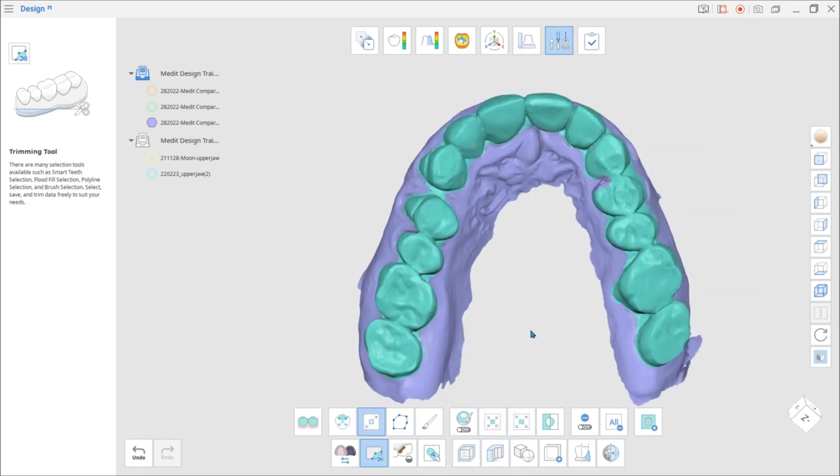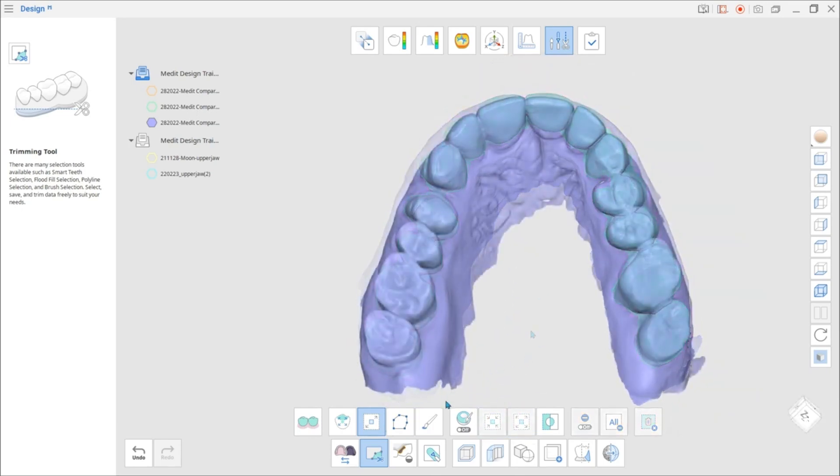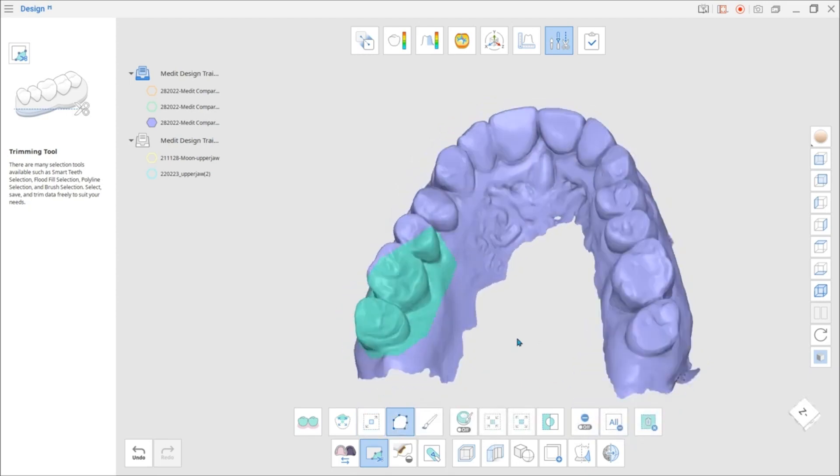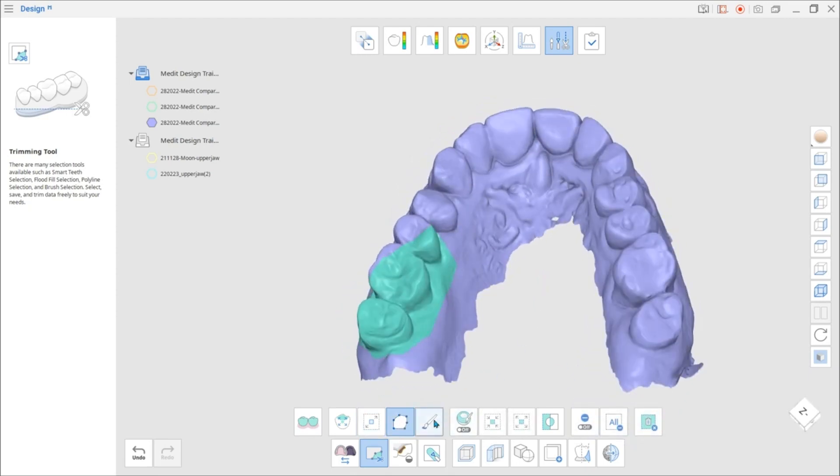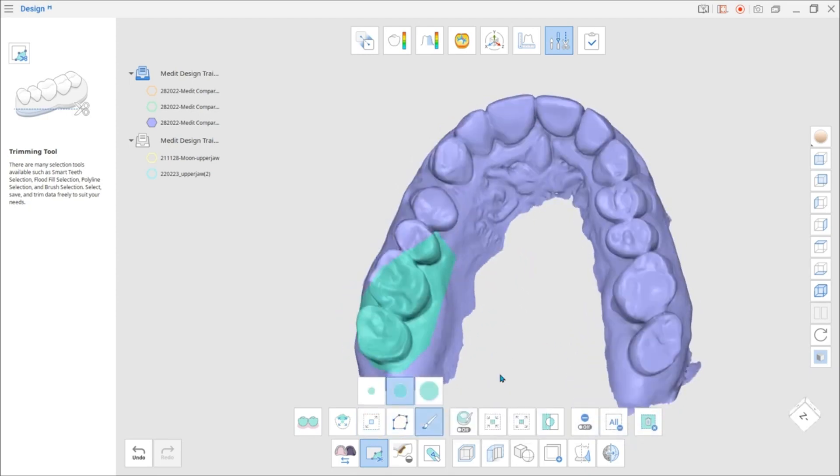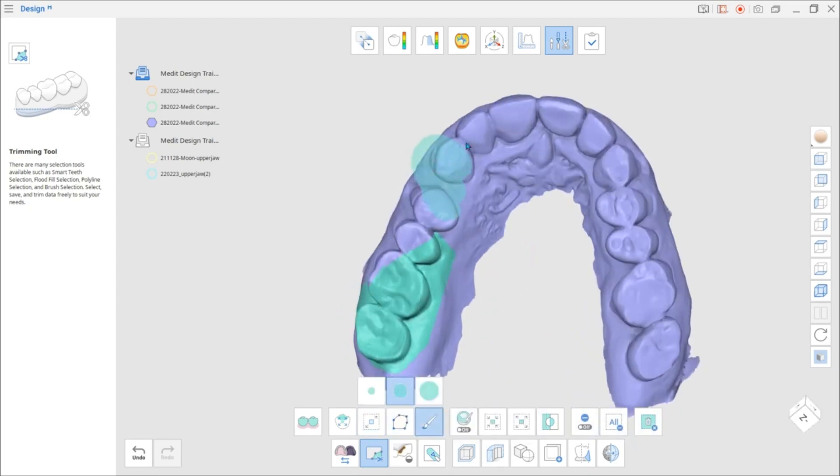If you have missed some small areas when working with a polyline or brush selection, they can be automatically filled in.